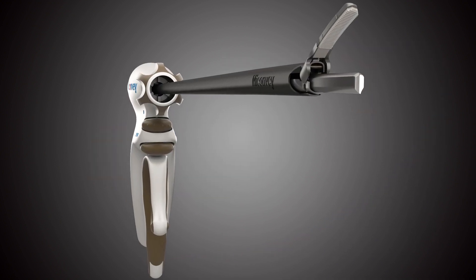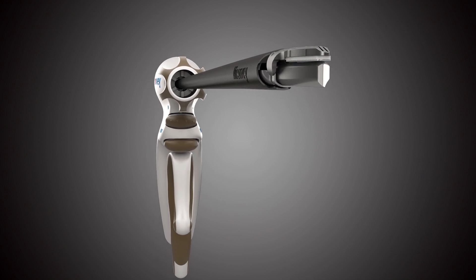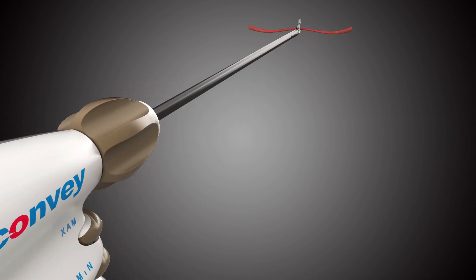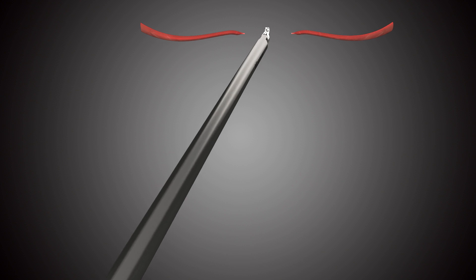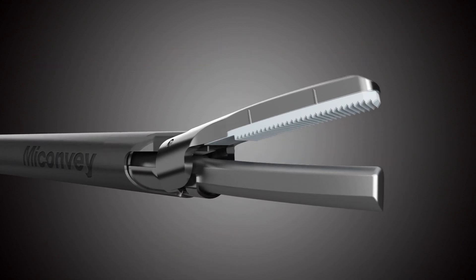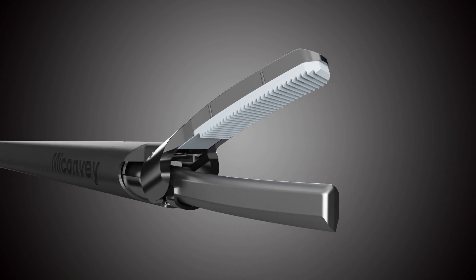Excellent cutting and haemostasis ability improves surgical efficiency and ensures safe operation. No tissue escarp, reducing intraoperative tissue damage and improving the quality of surgery. The enhanced tissue mat is stronger and wearable, providing a stable and high-quality surgical experience.